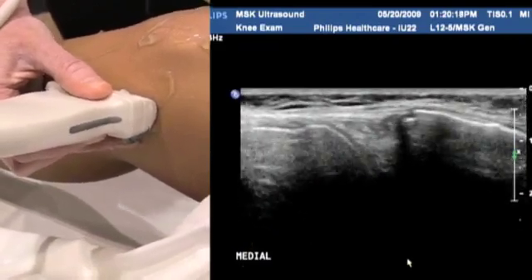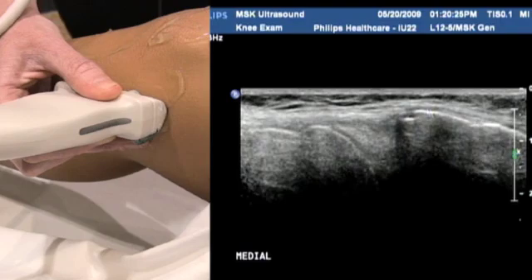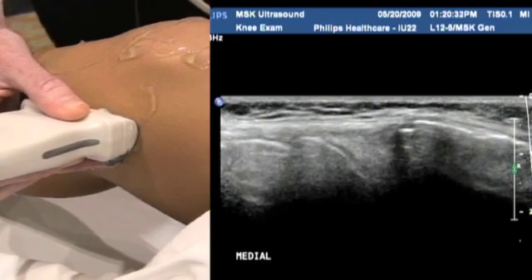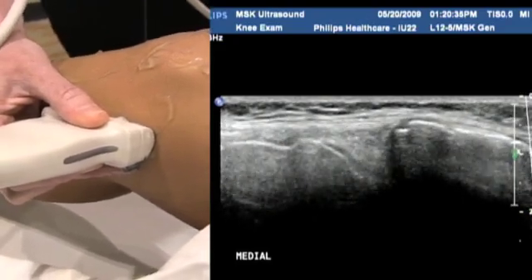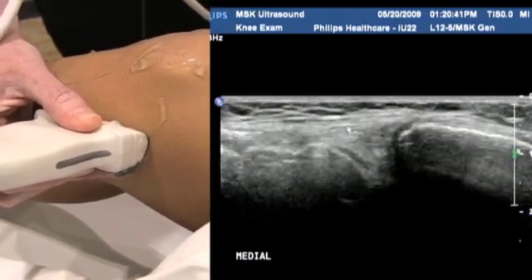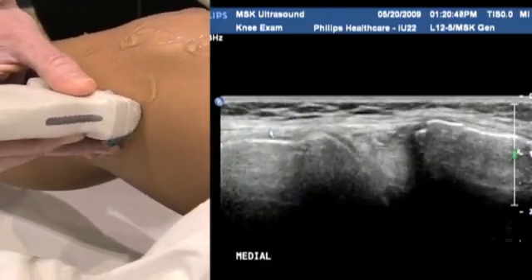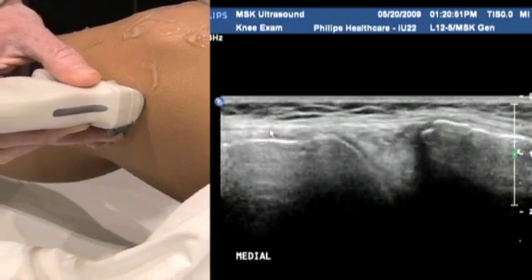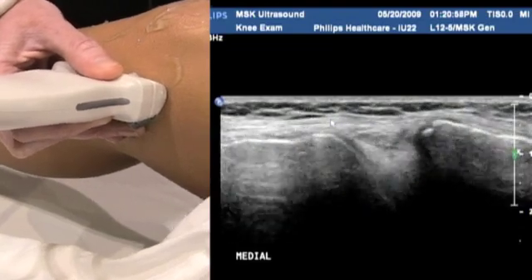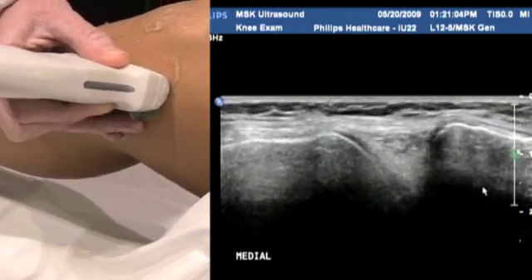Again, a little easier to see, I think, on the medial side than on the lateral side is the medial collateral ligament. You can see again, let me just make that a little bigger. Okay, be a good sonographer and bring my focus up to where it needs to be. Okay, so you can see here a number of linear fibers running across here, again attaching more proximally. That's the medial collateral ligament. It's the paired structure again with the lateral collateral ligament on the other side, but again it should appear nice and thin, nice and taut. Again, you'll notice the knee is slightly flexed for this procedure. So that's certainly something to be aware of.